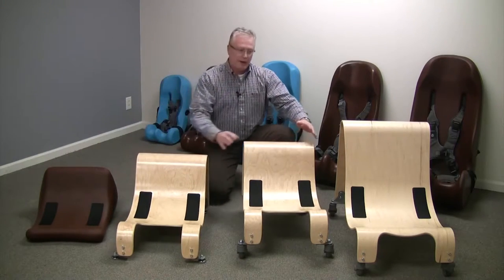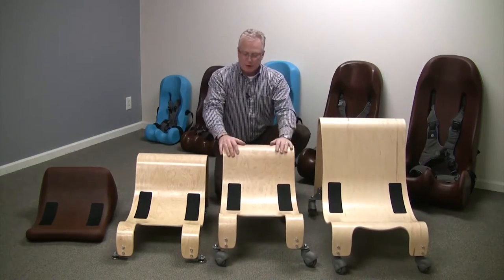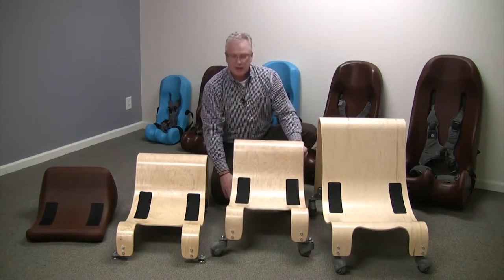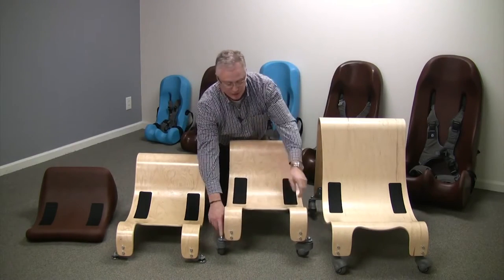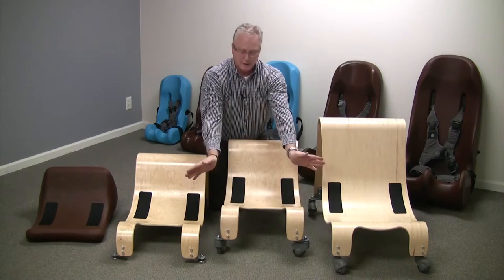Moving on, we have our mobile bases — our small and large mobile bases. The small mobile base, as you can see, has the rolling three-inch polyurethane casters on the front, with three-inch locking polyurethane casters on the rear. One thing I'd like to point out is that the casters on the front of the small mobile base are offset to the left and right.